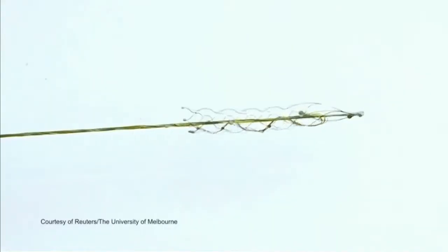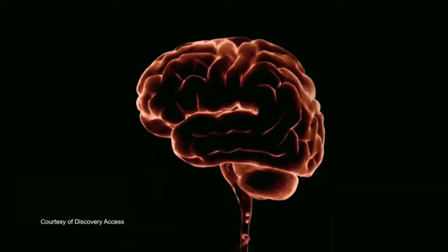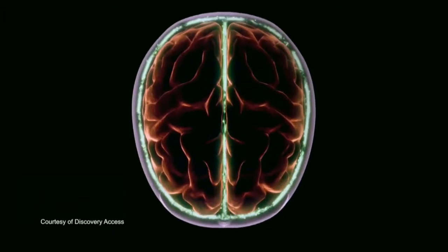Hi everyone, this is President Barack Obama. The US and Australia are funding research into a device that could someday allow people to control their prosthetics with their minds and without invasive brain surgery. When implanted into a blood vessel, this network of tiny electrodes can record your brain signals. Technology that has the potential to transform the lives of our wounded warriors and others with disabilities.